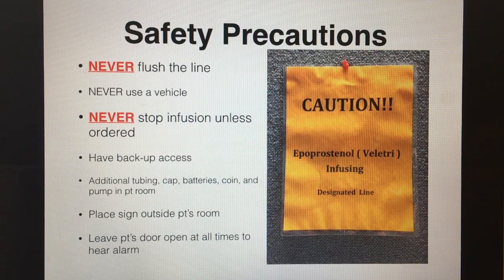And then you always want to make sure to leave the patient's door open at all times so that you're able to hear if the pump is alarming. Again, you heard earlier in the video the CADD pump alarm is not very loud. So if the door is completely shut, you may or may not hear the pump alarming. And again, if it's alarming, the medication isn't infusing.